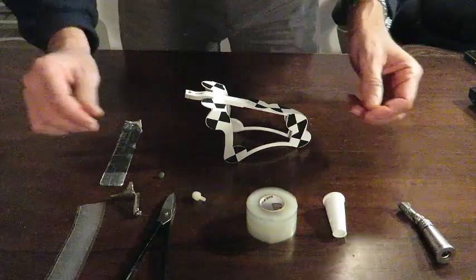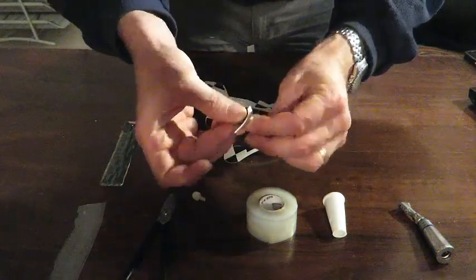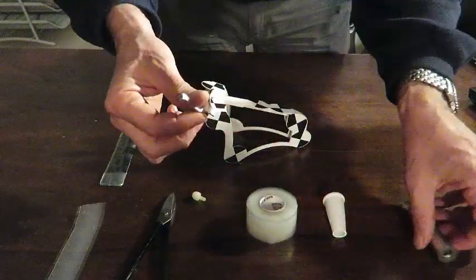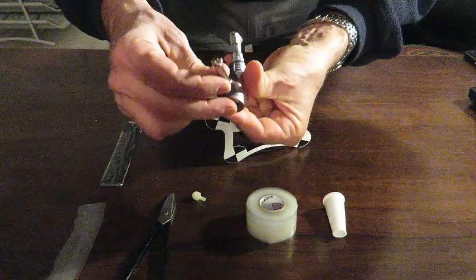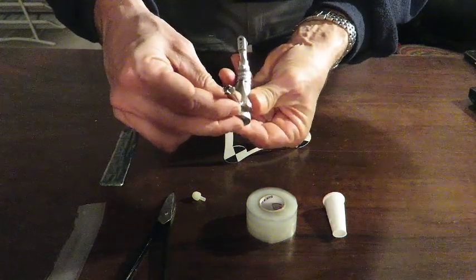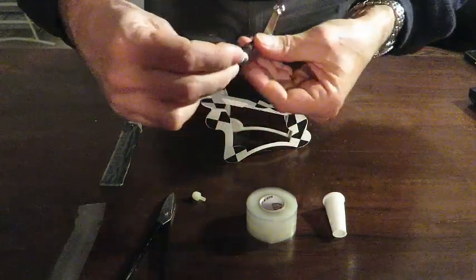So, in order to do that, what we are going to do first: we are going to put the patafix beneath the universal adapter, and we will put it in a way that can be aligned to the chuck of the contraangle.